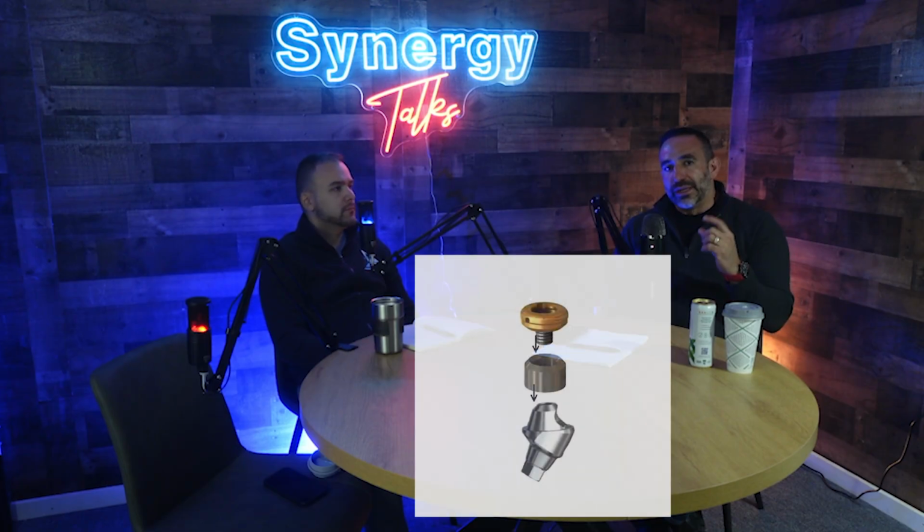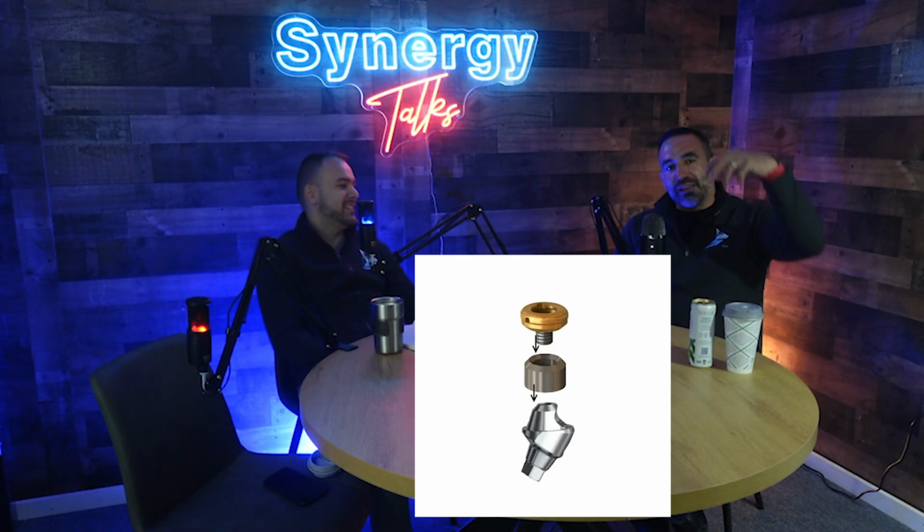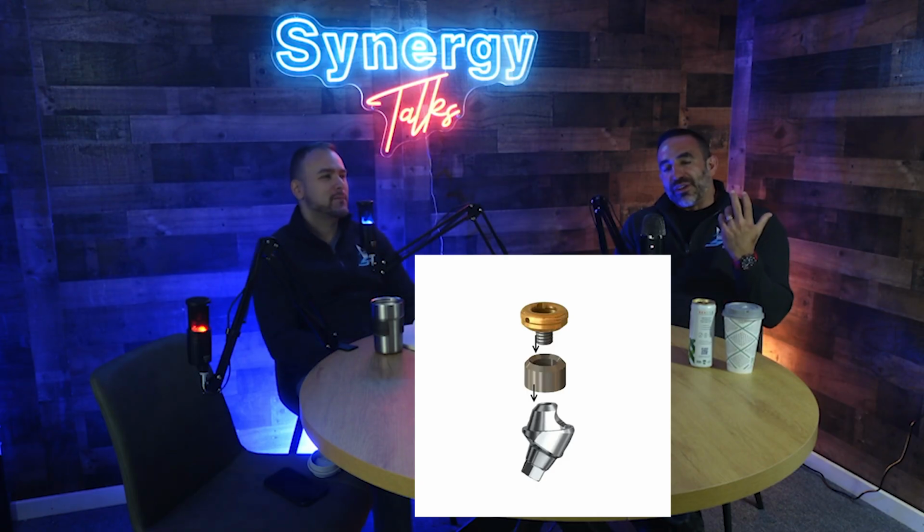Yeah, and the amazing thing is now there's so much evolution in locator abutments, right? When we first started in the business, they were just basically straight. They came in like a 0.5 millimeter, a millimeter and a half. But now they even make angled locator abutments through Zest. We've even done cases where you took a multi-unit and there's a sleeve that goes over top of it, and you get up to 35 degrees of angulation correction. So there are so many different options to get proper insertion direction, and also to ensure that we get the proper height, so we are getting the proper tissue support.